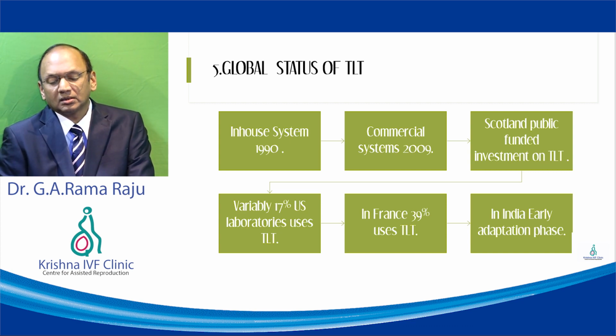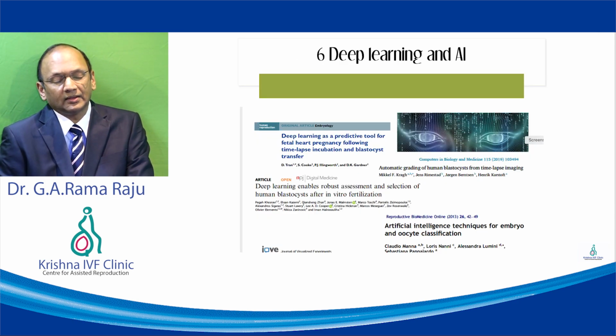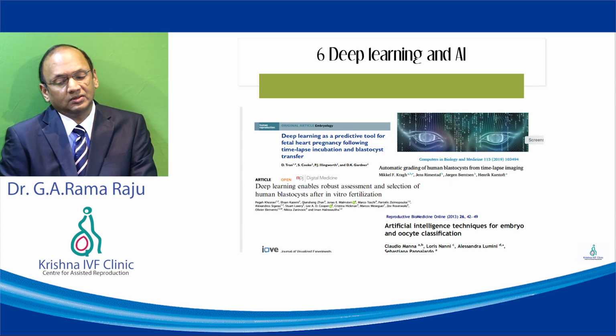In France, 39% of the clinics use time-lapse technology, and in India, it's in a very early adoptive phase. The other thing is, with the advent of AI, the predictions are becoming more and more efficient, and in another couple of years you will see much more robust prediction algorithms to make your selection much better and allow you to use fewer embryos.